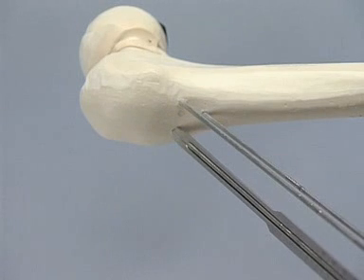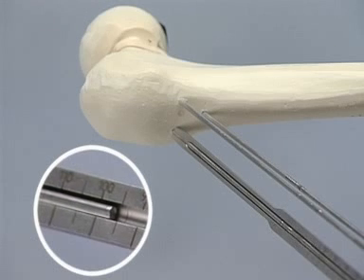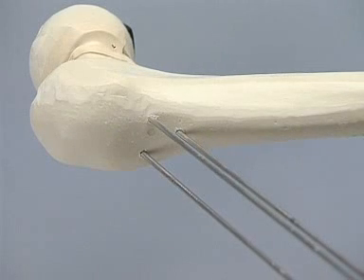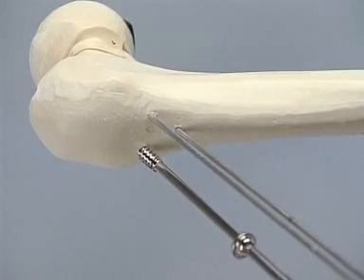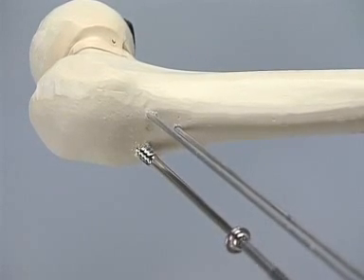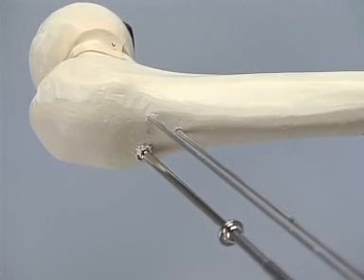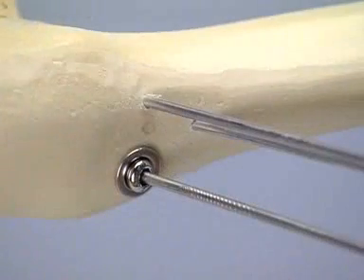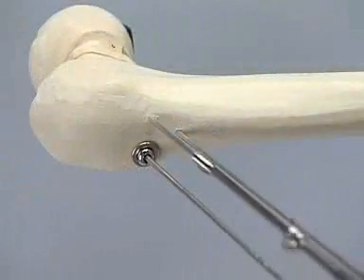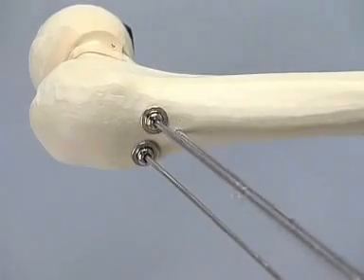Measurement of the screw length is performed using the direct measuring device. The new self-drilling and self-tapping 7.3 millimeter screw can now be inserted with the cannulated screwdriver. Only in very hard cortical bone will it be necessary to pre-drill the near cortex with a 4.5 millimeter drill bit. The use of washers may prevent the screw head from sinking in. The two remaining screws are inserted accordingly, and the guide wires are carefully removed.